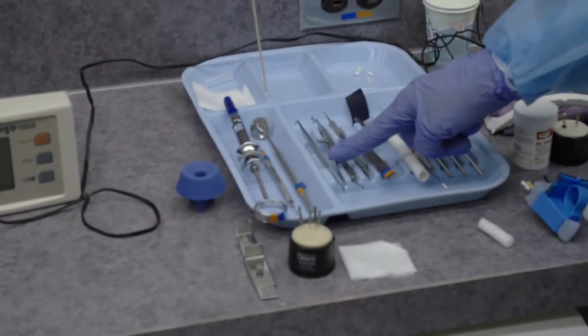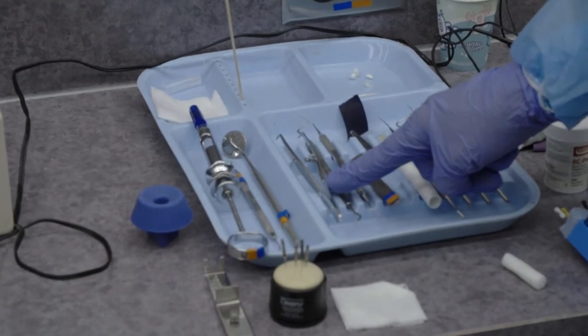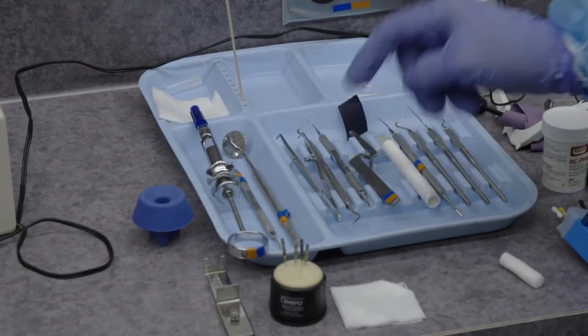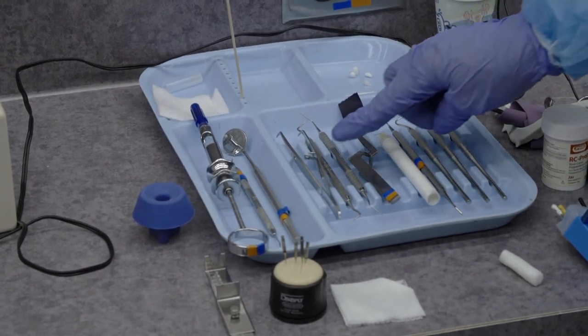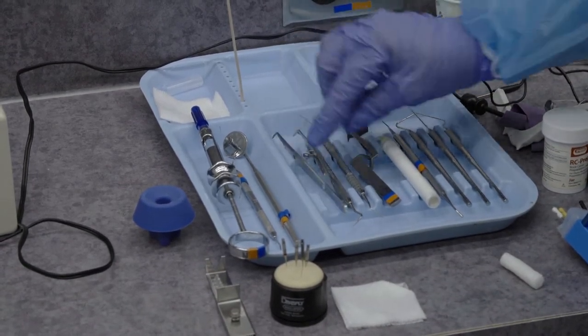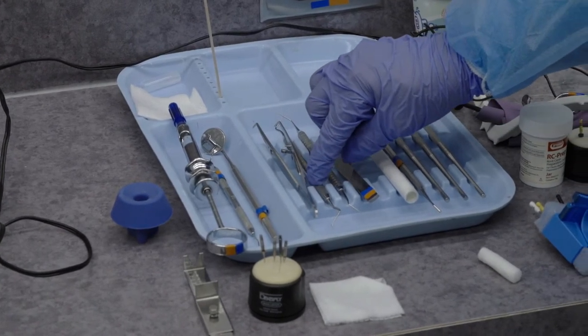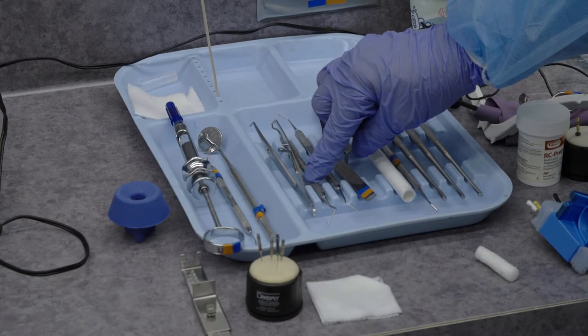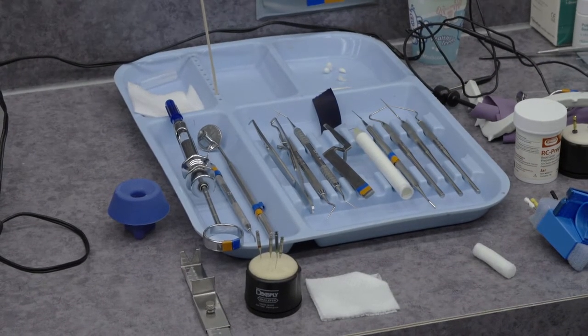The cotton pliers that we utilize for the procedure is the locking pliers rather than a regular cotton pliers. An endodontic explorer is utilized along with an endodontic spoon excavator. We have the dental dam set up.